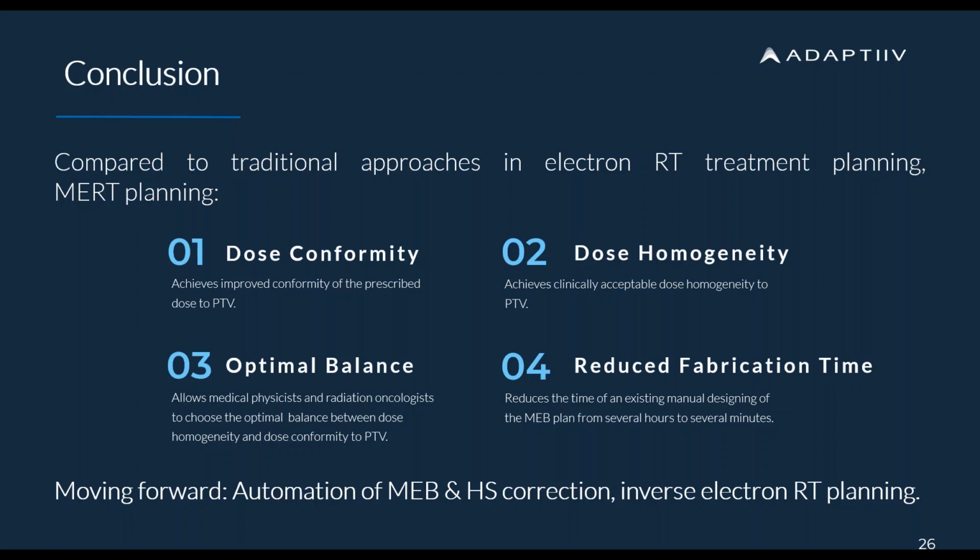But by using our hotspot algorithm and by reducing the peaks, the amount of electron scatter that focuses on the hotspot gets less and less, and basically that is how our hotspot correction works.